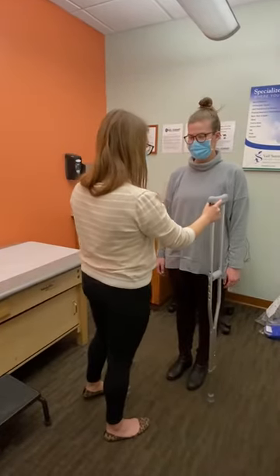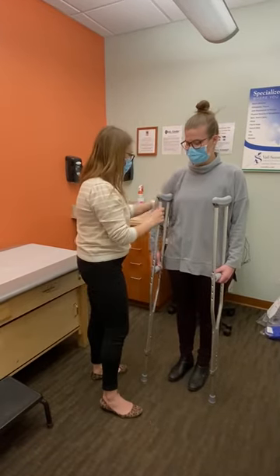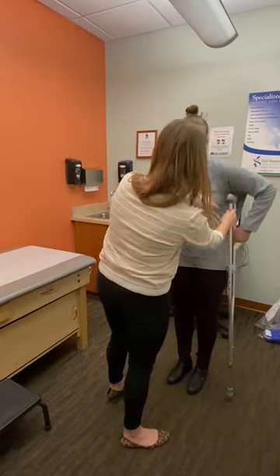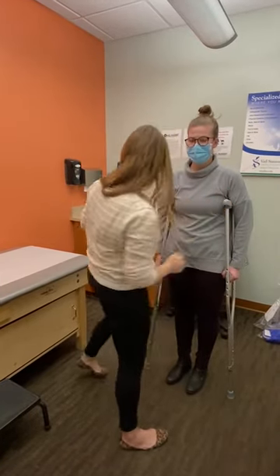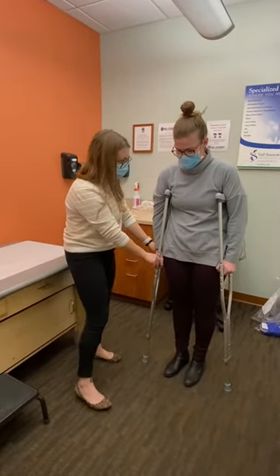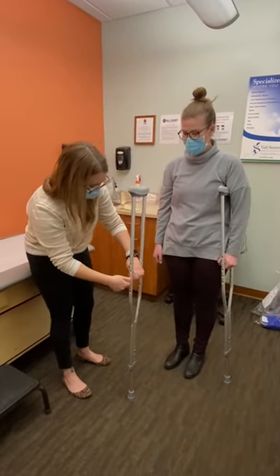When sizing your crutches, it is important to make sure that you have three to four finger breadths between the armpit and the crutch. Your elbow should be at a comfortable, functional angle that allows you to place appropriate support through your hands, as opposed to leaning through your armpits.